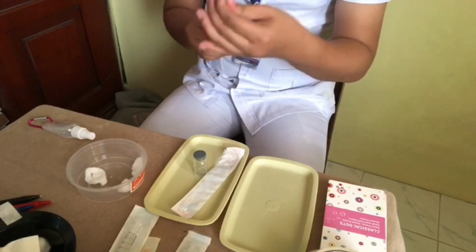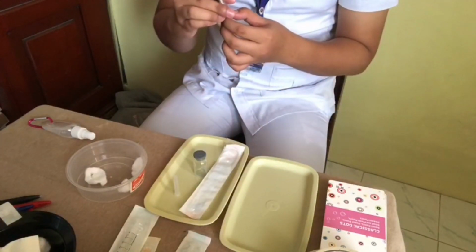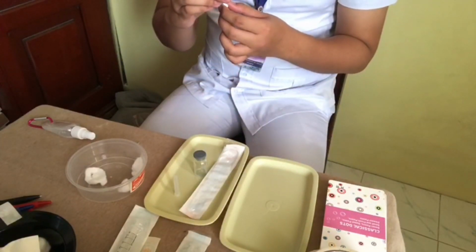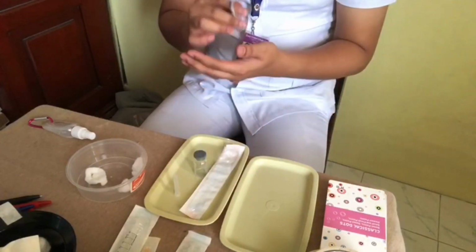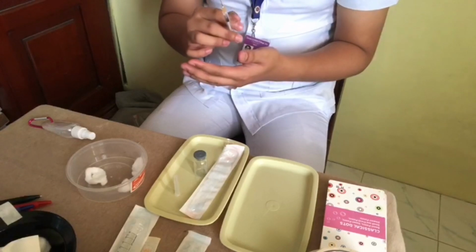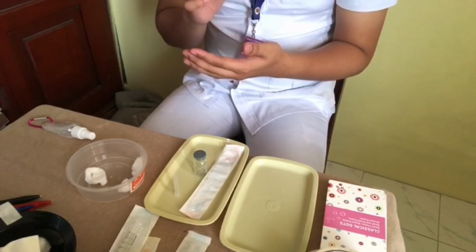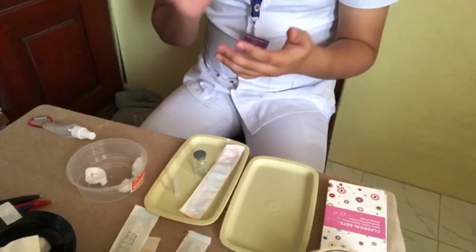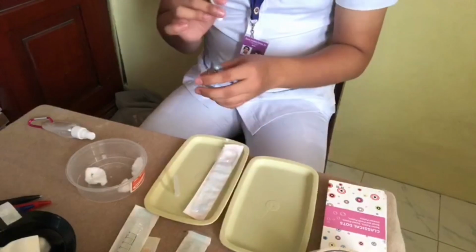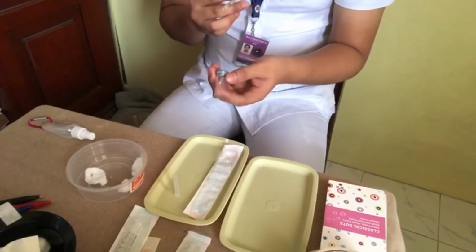I'm going to remove the cap and withdraw the amount. Then we'll inject the air into the vial while keeping the bevel of the needle above the surface of the medication to ensure sterility.